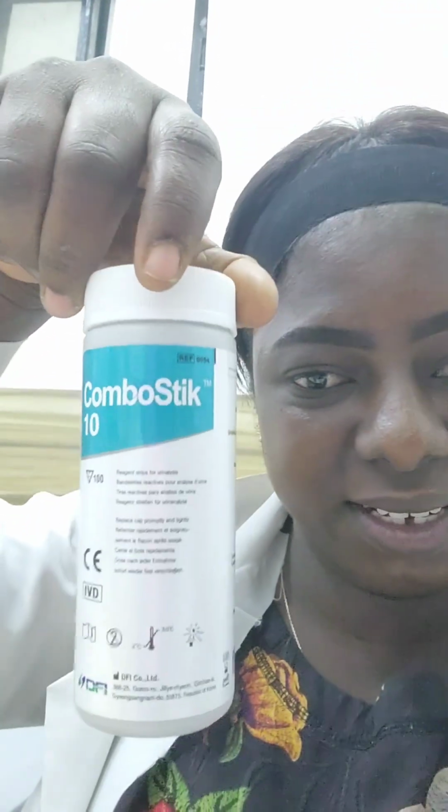Like I was saying, cloudy urine can indicate that the patient has a UTI, that is urinary tract infection, like I mentioned. It can be sexually transmitted infections. It can be a kidney stone. It can be diabetes. So to do this urinalysis test, we normally use a strip. Let me show you one of them. We call this one combo 10.